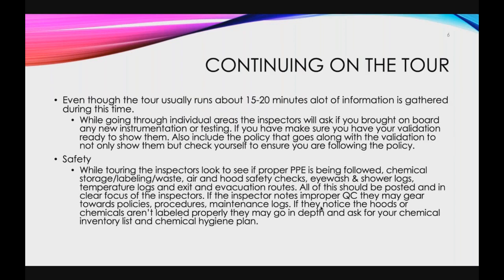So even though the tour usually runs about 15 to 20 minutes, a lot of information is gathered during this time. While going through individual areas, the inspectors will ask you what you brought on board, if you brought any new instrumentation or any new testing. So for immuno, if you brought any new antibodies or special testing, maybe you got rid of some special testing, maybe you were doing it manually and you got a new special stainer that's now automated. So you want to make sure, they'll want to see that, and they'll look for it.